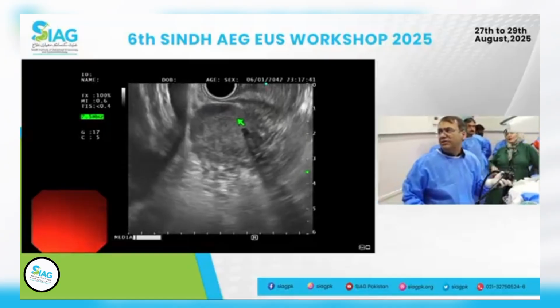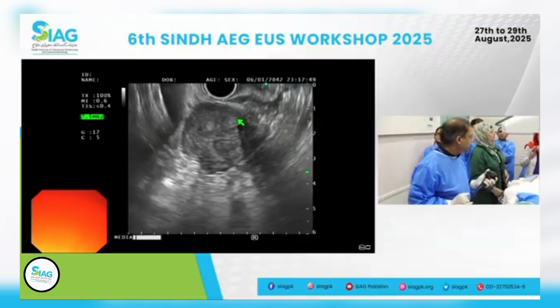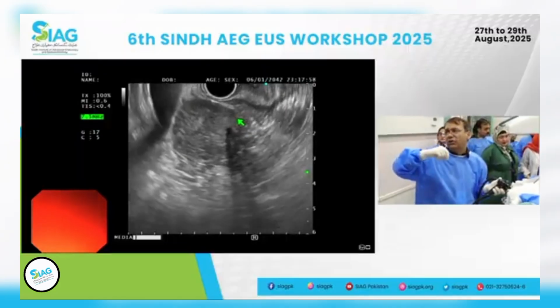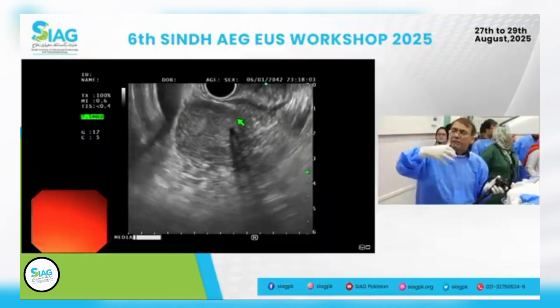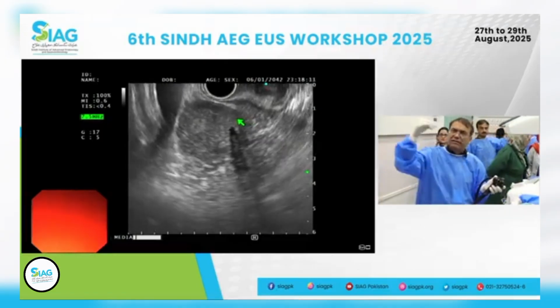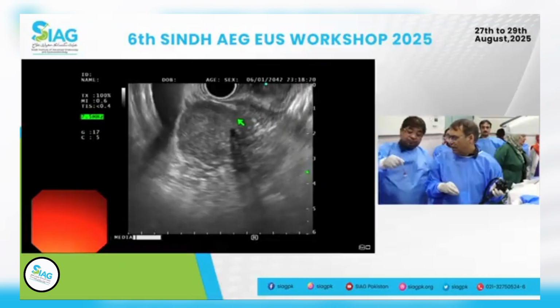Khalid, in terms of your preference, is it dry suction or wet suction? No, I use dry suction. And what about the slow pull? We can do that. I usually don't use a stylet, but you can do the slow pull with the stylet. That kind of creates a vacuum, but it has to be coordinated with the tech. When you go in, your tech pulls the stylet back and keeps pulling it back, but that needs to happen when you are going into the mass.